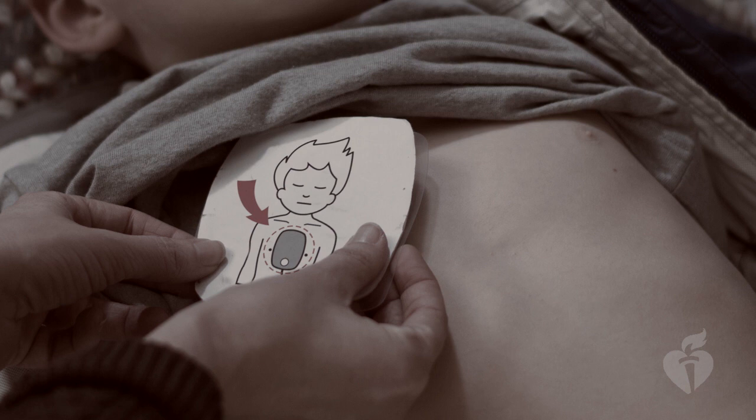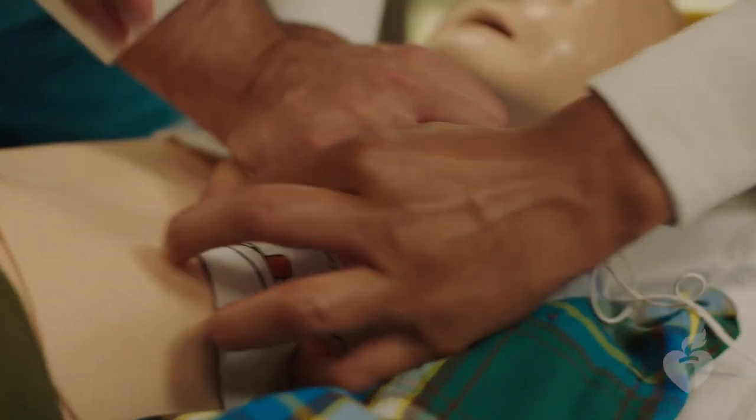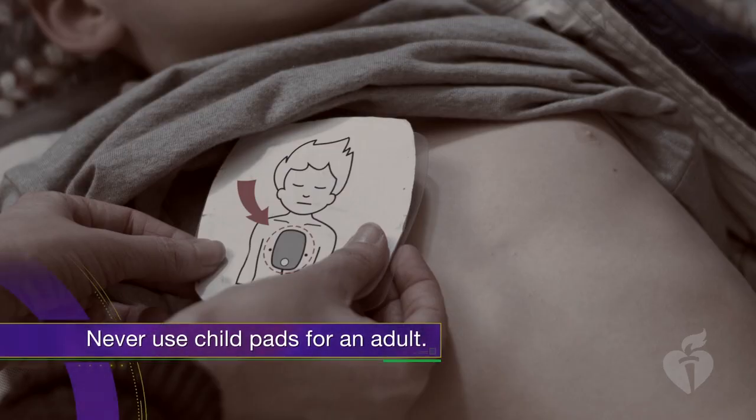But the type of feature available depends on the type of AED you're using. Your AED may include smaller size pads designed for children under 8 years of age. If it does, use them. If not, use the adult pads, making sure they don't touch or overlap. However, you should never use the child pads for an adult. The shock dose delivered by child pads is too small for an adult, and it will likely not be successful. It's better to provide high-quality CPR than to attempt to shock an adult victim with child pads.